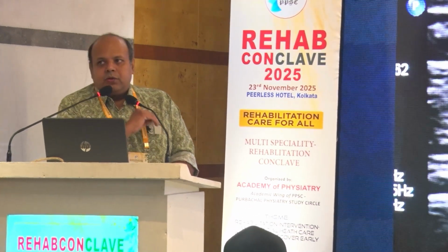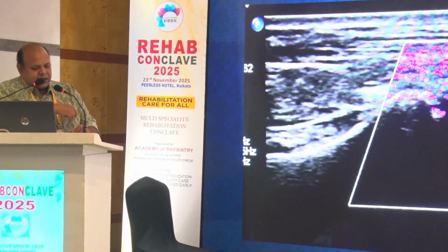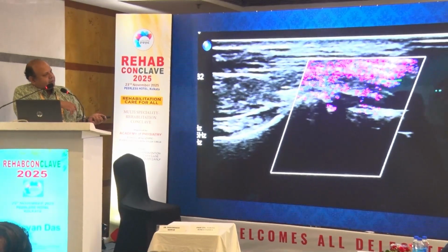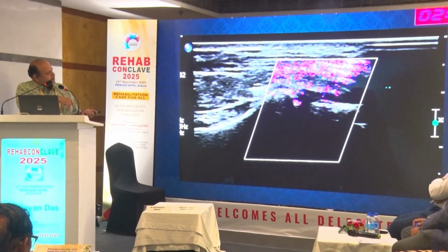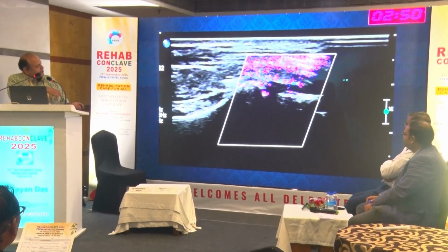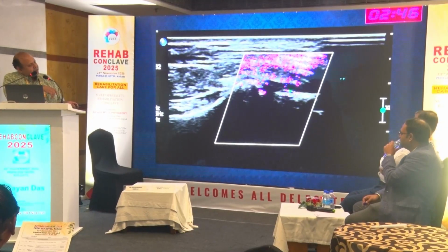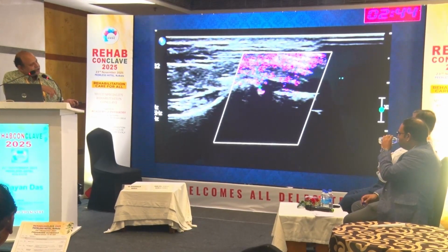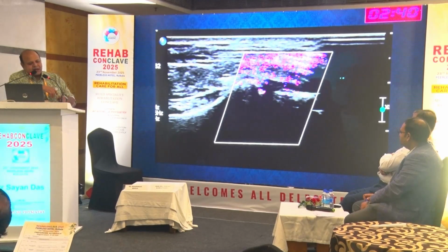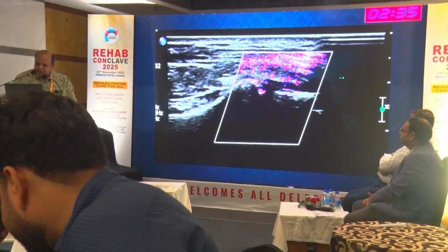There is no angle correction needed for the power Doppler. Now in this image, you see there is a lot of artifact around the joint because these are the muscular vessels and these are the joint. This is the wrist joint and this is the synovium. You can also take the spectra from this to rule out whether it is artifactual or it does have a spectra. Usually these spectras are biphasic with high diastolic flow, which shows the inflammation.